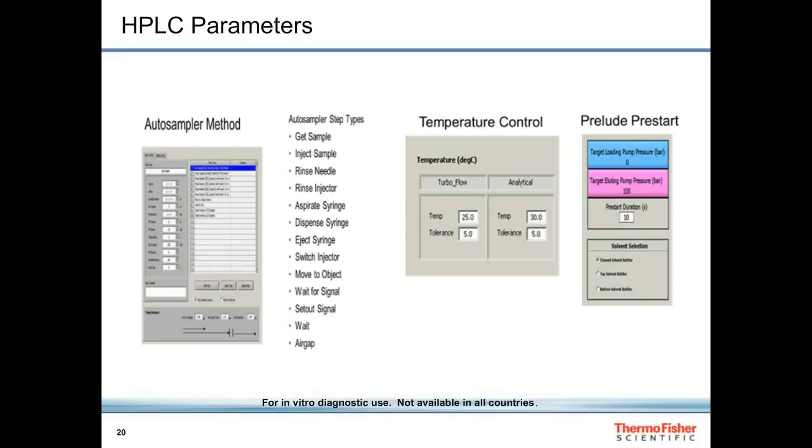The pumps quickly refill, and just before the next injection, the pumps pressurize with solvent conditions specified at the beginning of the LC method. This way, we get reproducible chromatographic peak shapes and retention times while saving a tremendous amount of solvents.